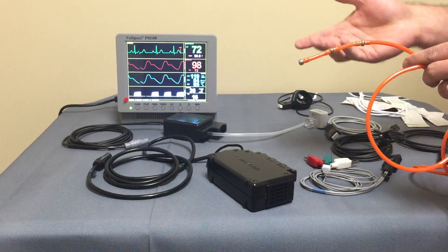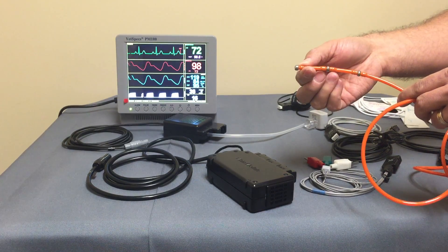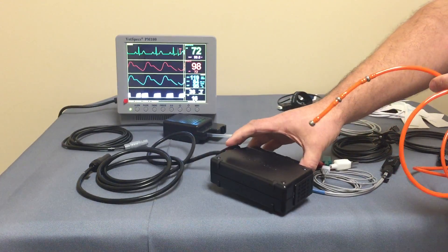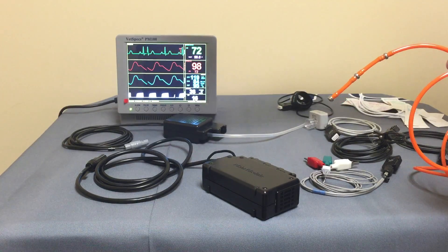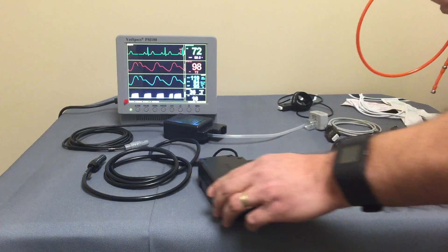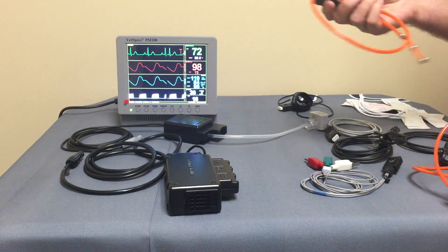By inserting the probe into the esophagus, you're going to get a beautiful EKG due to its proximity to the patient's heart — really an uncompromised, incomparable heart rate. VetSpecs has also built in a temperature sensor, so once this is in the esophagus you're getting EKG, heart rate, and core temperature with one connection to the body. The module would be near the head of the patient, and VetSpecs provides an extension cable about two and a half to three feet long if you need more length.